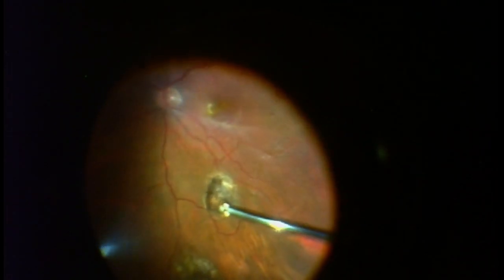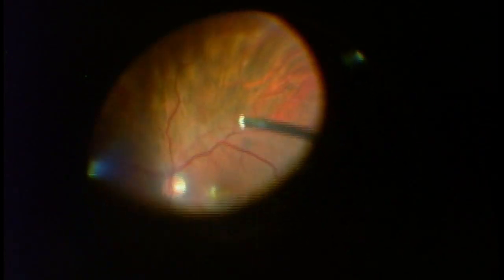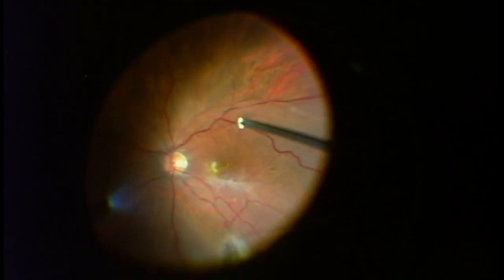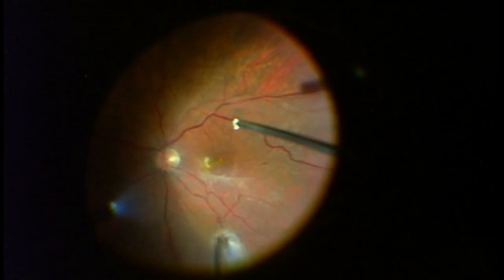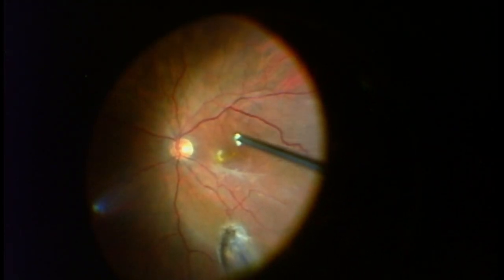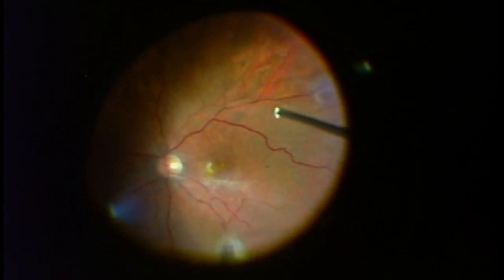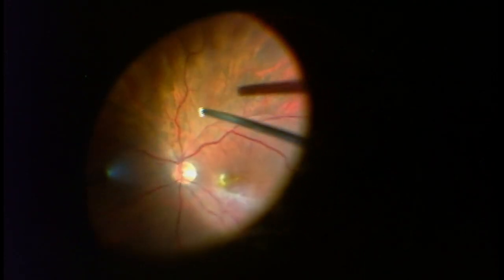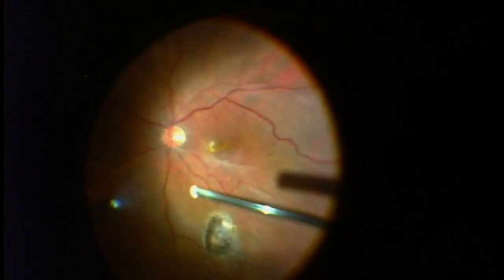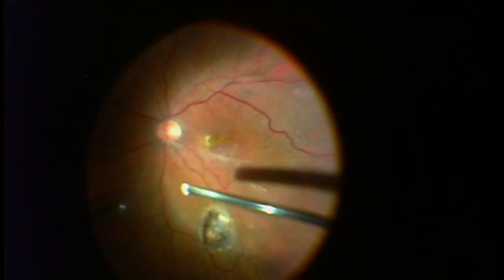This is a follow-up video on a patient in whom I repaired a complete retinal detachment several months before this surgery. The patient is about 60 to 65 years old, female, and had a complete retinal detachment about two months and two weeks, almost three months before this surgery.